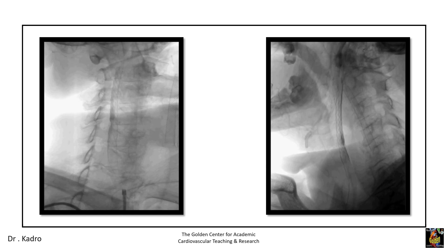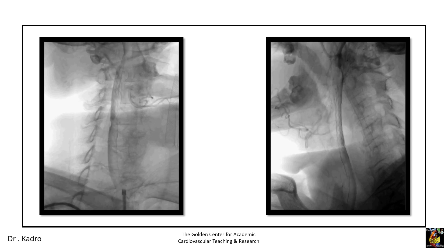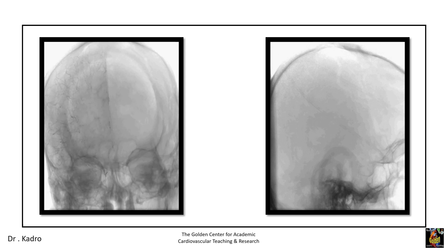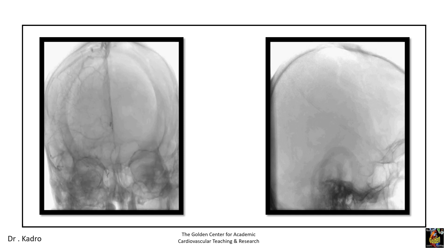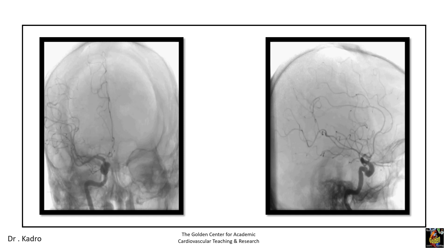There is a little pinching of the right external carotid. The intracranial angiogram shows good perfusion to the brain with no loss of any side branch — this is the AP view. The lateral view also confirms good perfusion.